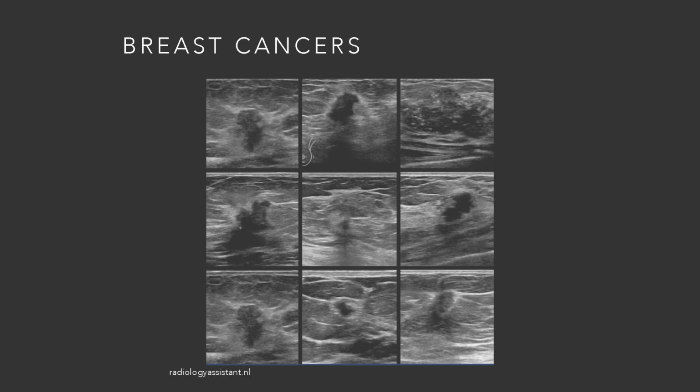Right. Here are 9 images of cancers. You can see how these look different. They're more irregular shaped, kind of fuzzy, indistinct margins. We talk about them being more vertical, or taller than wide, and so looking from the top down, they just have a more vertical appearance. The top right image, there are little white dots inside the mass. Those are actually calcifications, which we would be able to see on mammogram and characterize as concerning looking calcifications. So these are all cancers.